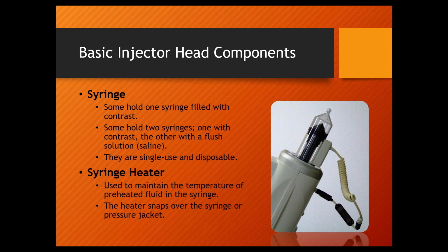Now, a lot of places don't use the heaters anymore because of the technology with the CT systems. What used to be a 5-minute CT is now a 15-second CT nowadays. So the patient's not on the table as long as they used to be. So a lot of places don't use the heaters anymore because the procedures are over much quicker than they used to be. Some still use them, but some don't. But the purpose of the heater is what happens to syrup when you warm it up. It makes it more runny. It flows more easily. So that's the purpose of the heaters, to keep the contrast warm during longer procedures and things like that.